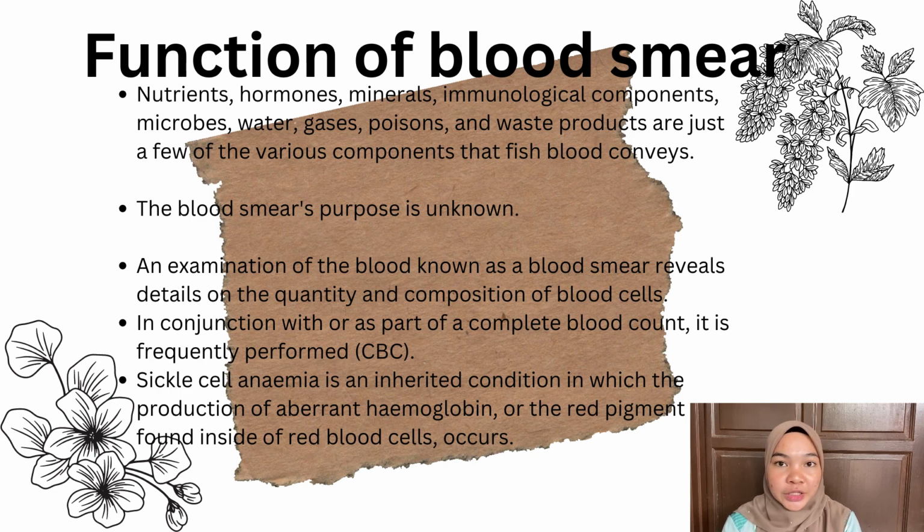Today, I will talk about what is blood and the function of blood smear. Blood is nutrients, hormones, minerals, immunological components, microbes, water, gases, poisons, and waste products are just a few of the various components that fish blood conveys.